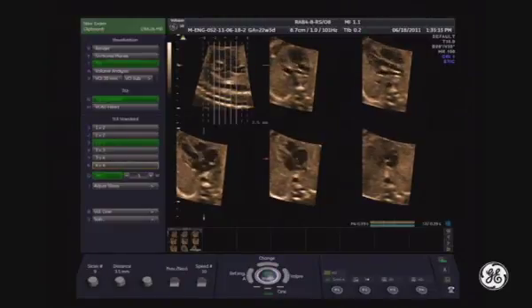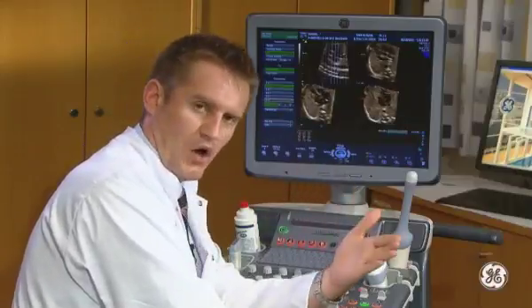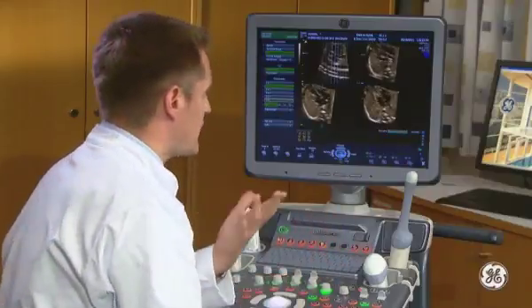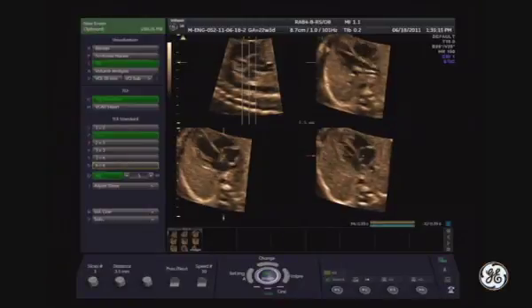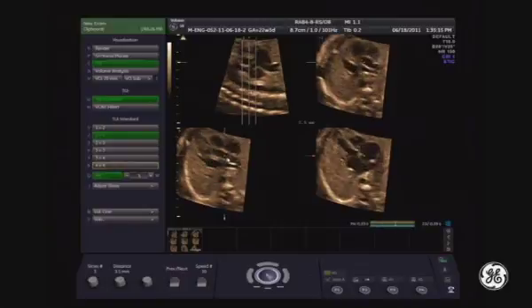But sometimes we need just 3 of them, 3 representative slices, like the 4-chamber view, aorta, so the 5-chamber view, and the 3-vessel or 3-vessel trachea view. These are the most representative ones. And we can try to bring the middle one to the level of the aorta, like here. So this is the central point.